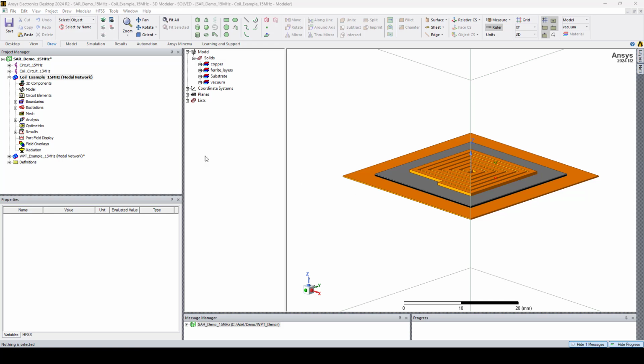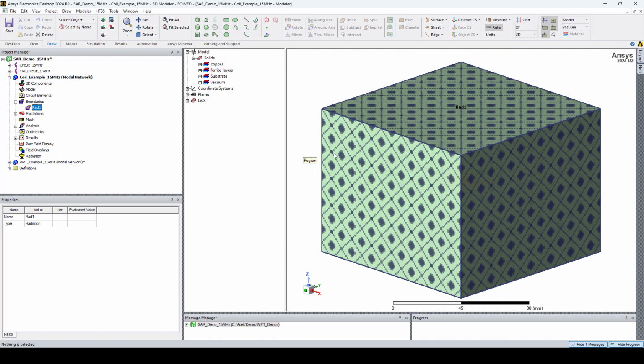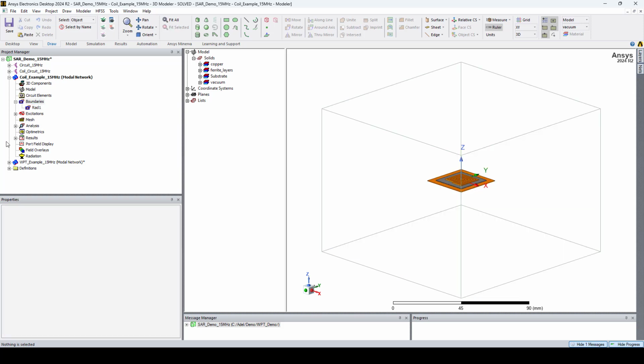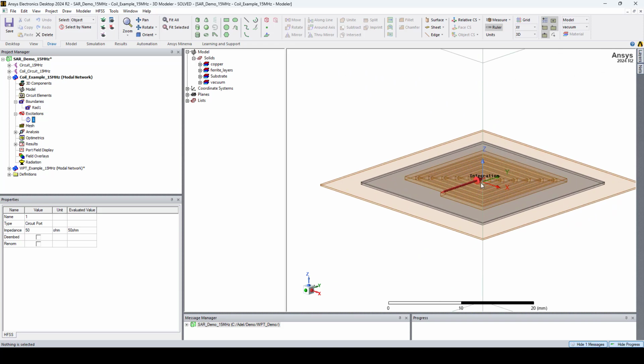If we go to the project manager, we can see the applied boundary conditions. Here we have a radiation boundary condition applied to the airbox, and for the excitation, a 50 ohm circuit port was used.